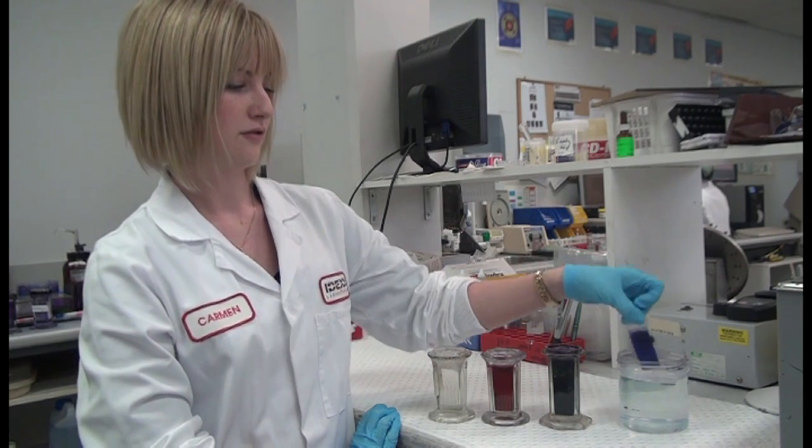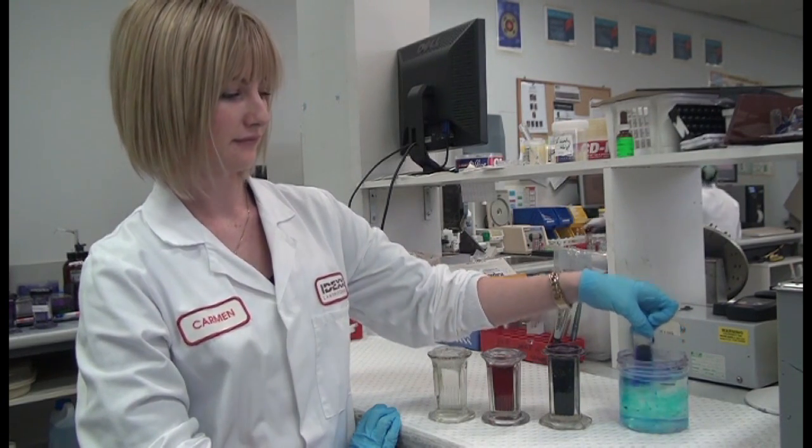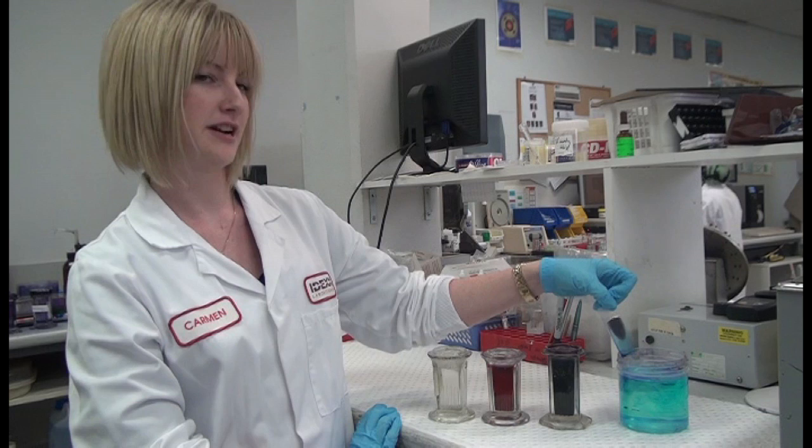Then rinse off in water. And there you have your stained slide. Just let it dry and it's ready for reading.